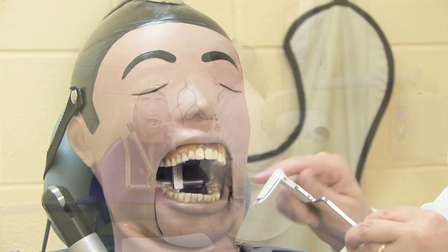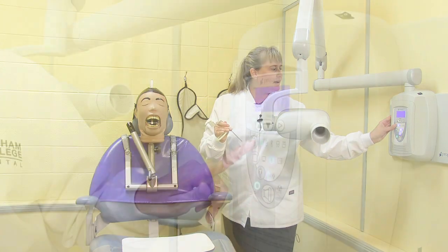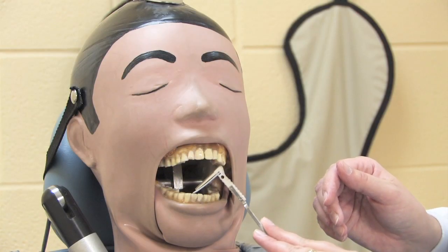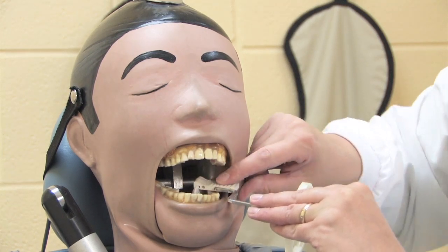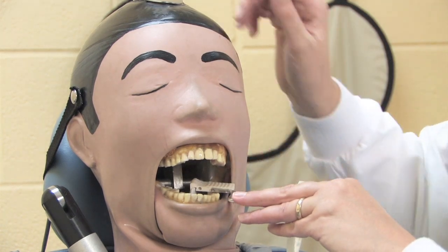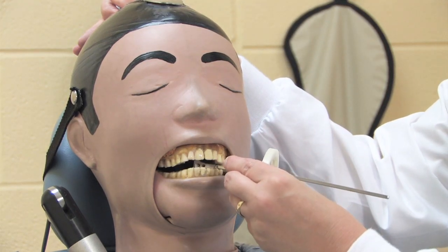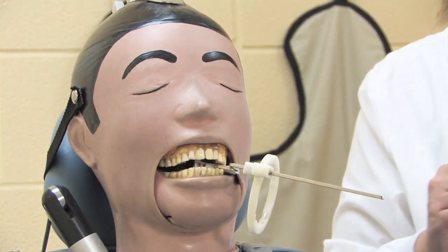I'll start with the premolar on the mandible. So again, I'll change the icon to premolar on the control panel. The film is placed away from the lingual side of the teeth. I'm positioning the film parallel to the long axis of the teeth, as well as imaging the distal half of the cuspid or canine.